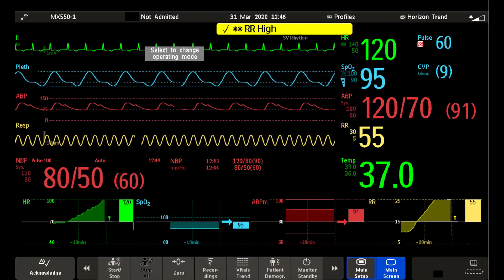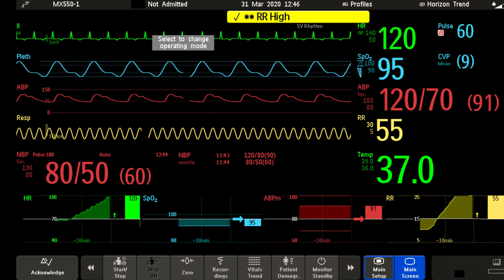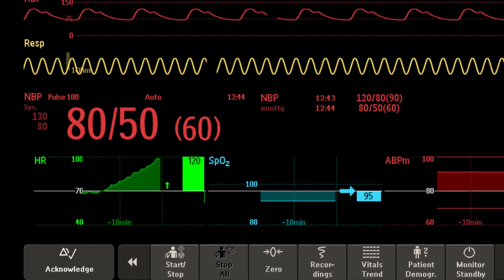And this is horizon view. Horizon view presents trend information superimposed over a defined baseline or base range. It helps you visualize changes in your patient's condition since the baseline was set.